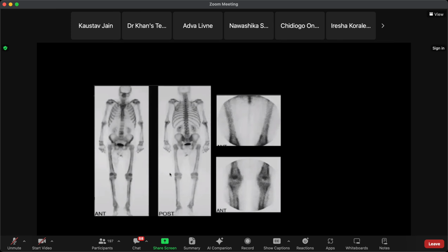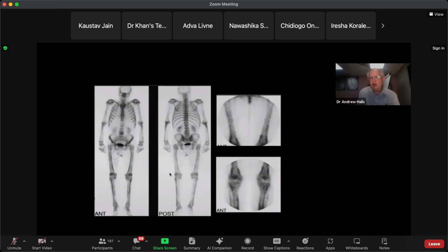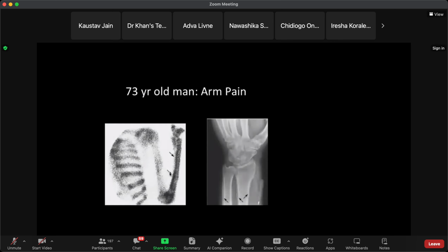The thing that I would be concerned about is HPOA. Have they got effusions, and have they got a symmetrical diffuse periosteal reaction secondary to... Yes, that's right. This was hypertrophic osteoarthropathy.